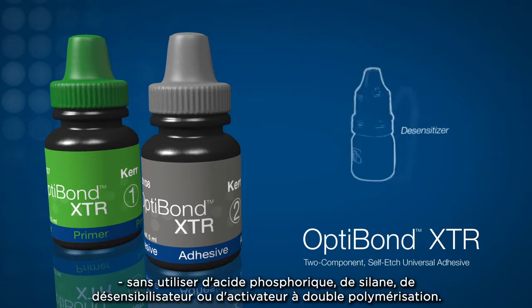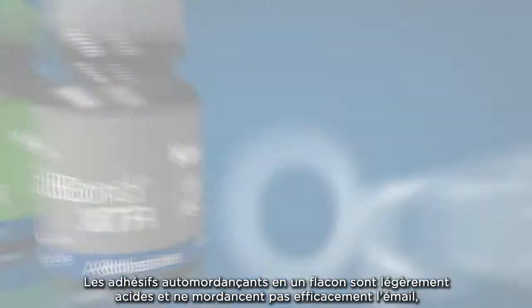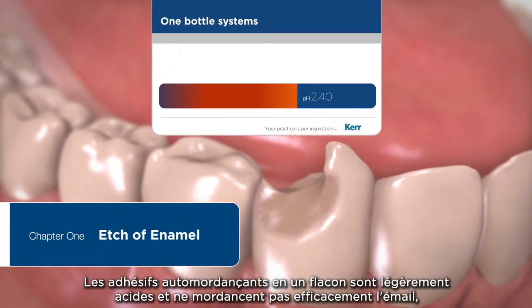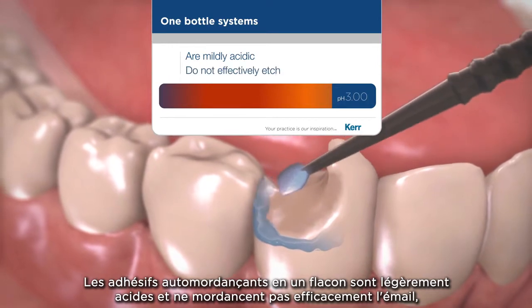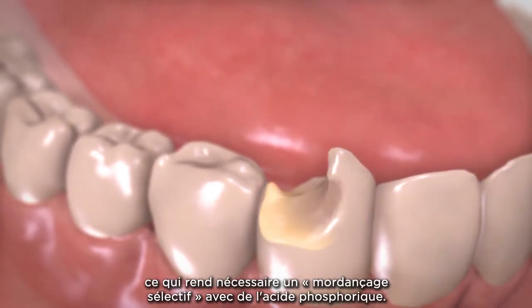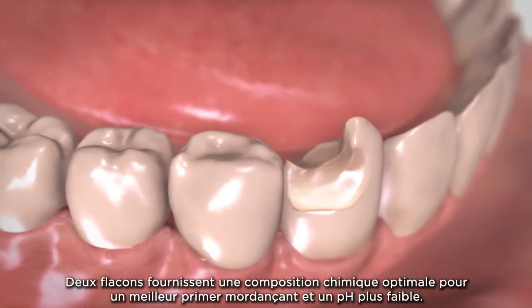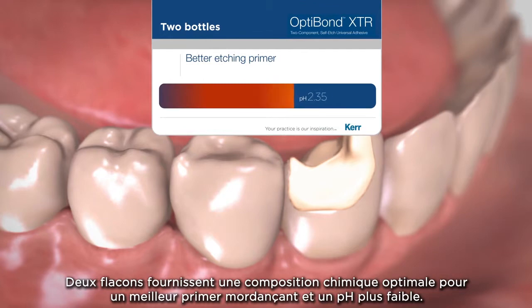OptiBond XTR requires no silane, desensitizer, or dual-cure activator. One-bottle self-etch bonding agents are mildly acidic and do not effectively etch the enamel, requiring selective etching using phosphoric acid. Two bottles provide optimum chemistry, allowing for a better etching primer and lower pH.